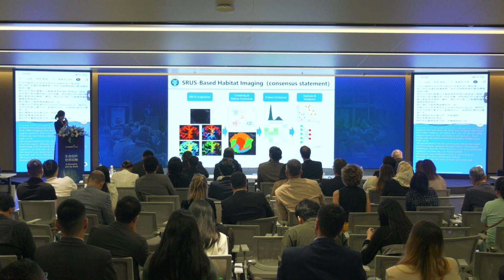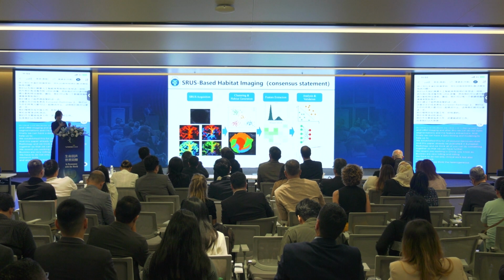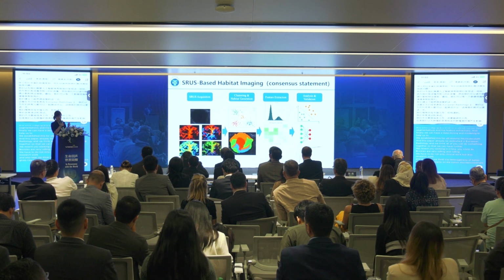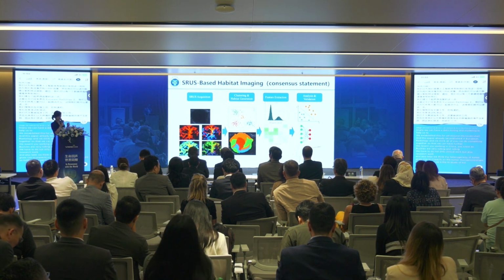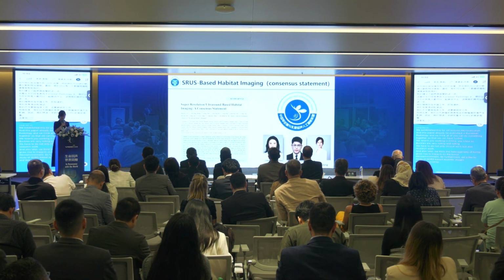And also later, we think the heterogeneity of the tumor gives rise to impacts on the tumor microenvironment. So furthermore, we'd like to study SRUS-based habitat imaging. And this is another paper that we already published.